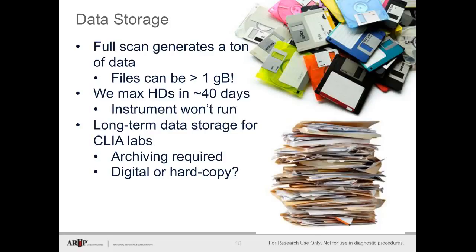Since we're collecting full scan data, the instrument generates a ton of data. So files can be greater than 1 gigabyte per sample. Data storage is a big issue. We max out hard drives in about 40 days. Once a hard drive is full, the instrument won't run.